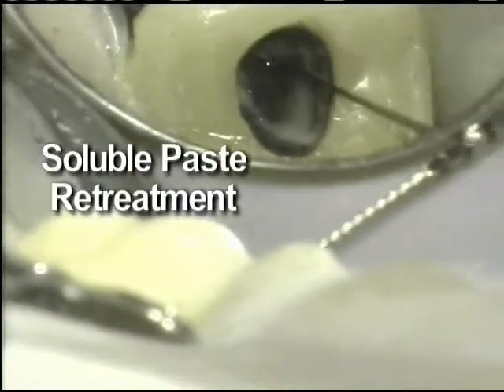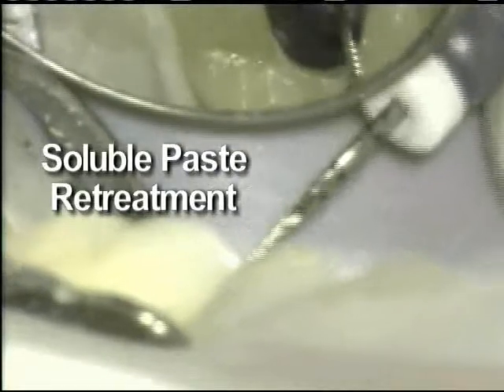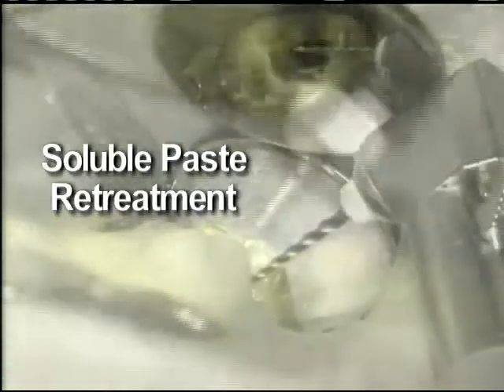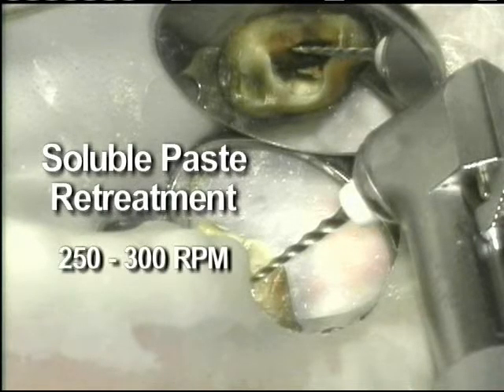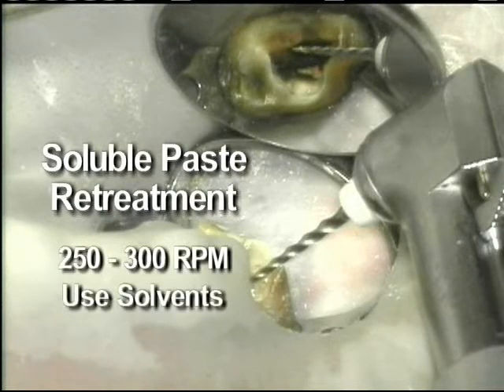For soluble paste fills, the retreatment sequence is the same. The only difference is that the ProTaper Retreatment files are run at 250 to 300 RPM, and solvents are also used to soften the filling material.